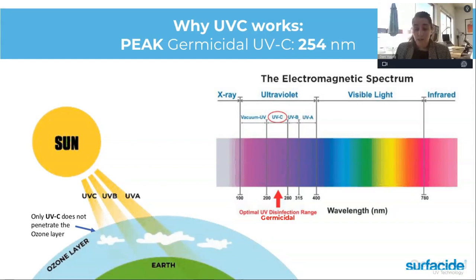And I saw, so using it for 2 to 3 minutes between patients is as effective as using it for 15 minutes. Again, it really depends on the space, but yes, 2 to 3 minutes in between patients is really keeping the bioburden down, especially if you are already doing your cleaning and wiping. If you do it for 15 minutes, you're going to get an overabundance of light in that area. Things that are already deactivated are going to be deactivated by that time.